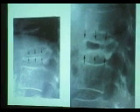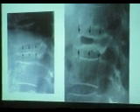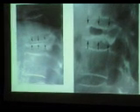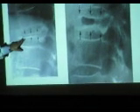This is another thing you should be able to do with X-rays. This X-ray was taken in standing position, and this X-ray was taken in the lying down position. If you look at this, you see the fracture opening up in supine position. That shows there is some amount of non-union in the fracture, and it is opening up in lying down position. If you can place the patient on the operating table in this position, you should be able to squeeze some cement into the vertebral body. But if you look at this X-ray, you will never be able to squeeze in the cement in this position.